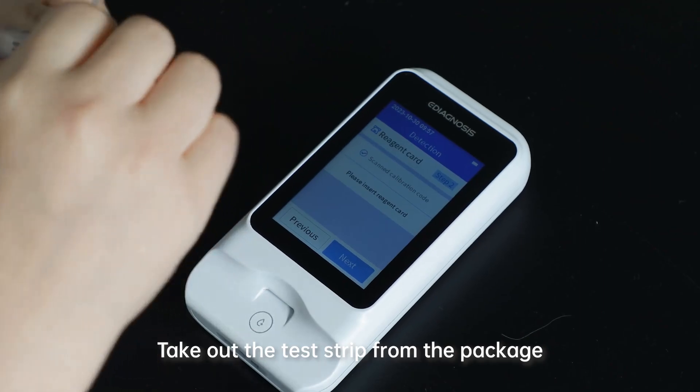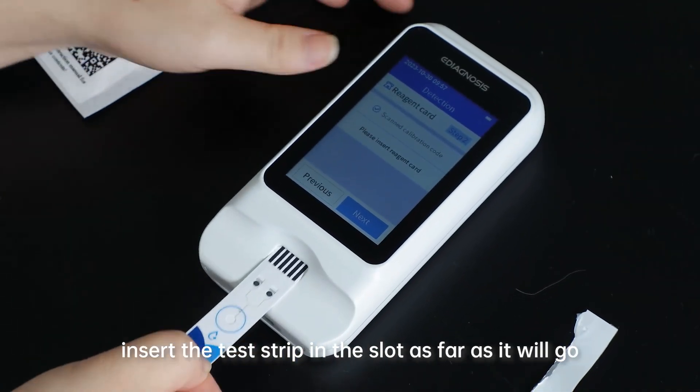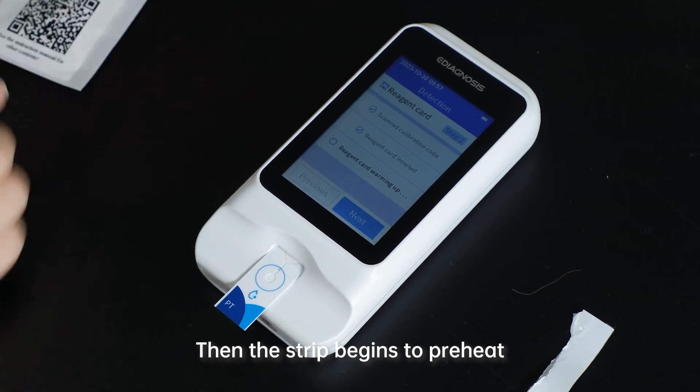Step 5: Insert Test Strip. Take the test strip out of the package and insert it into the slot as far as it will go. The strip will then begin to preheat.